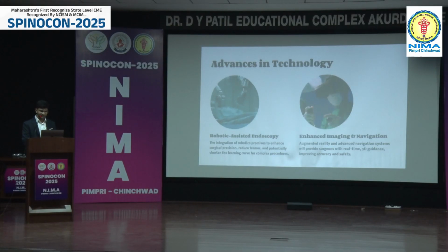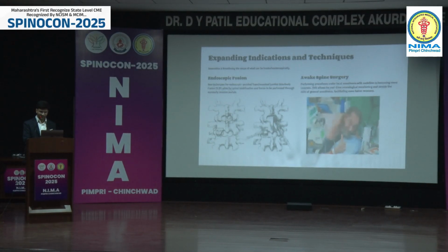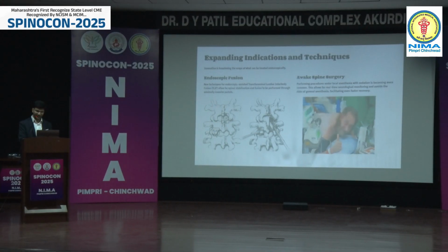Endoscopic spine surgery is expanding its indications and techniques. We are already doing endoscopic fusion as well, where we are putting screws after endoscopic discectomies. And the second is awake spine surgery, which is transforaminal endoscopic spine surgery that can be done under local anesthesia.